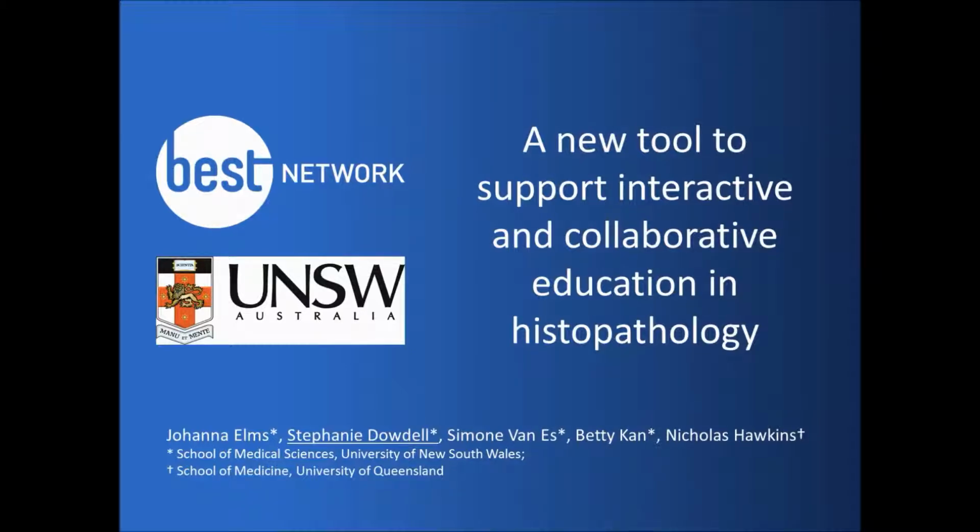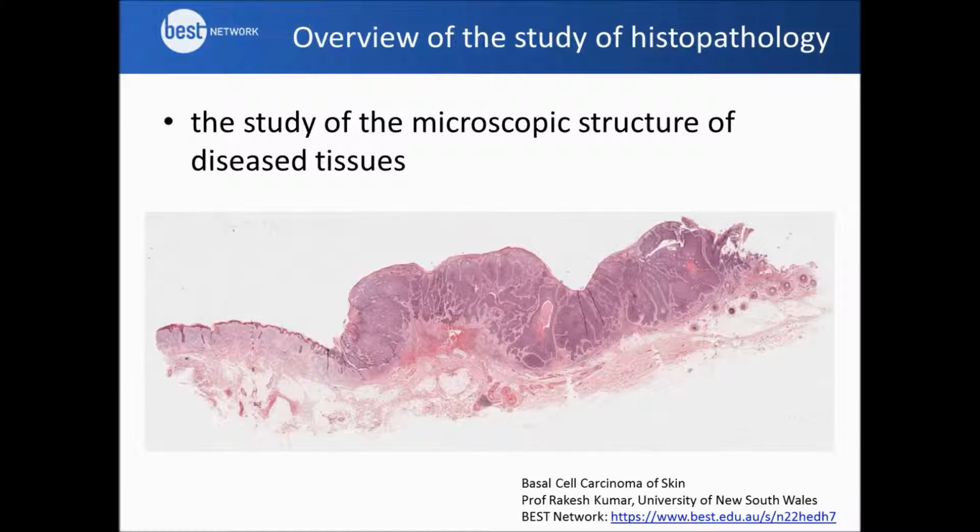This project was a collaboration set up at UNSW to develop and trial a new tool for running histopathology classes, where we aimed to provide an interactive and collaborative experience utilizing a digital image bank in face-to-face classes. Histopathology is the study of the microscopic structure of diseased tissues, and it's used in a clinical setting to diagnose disease and help identify the best treatment.